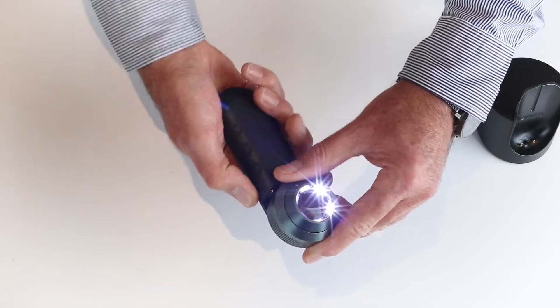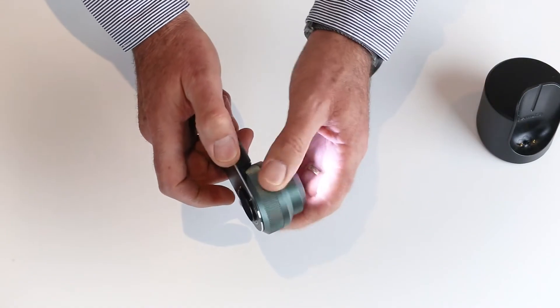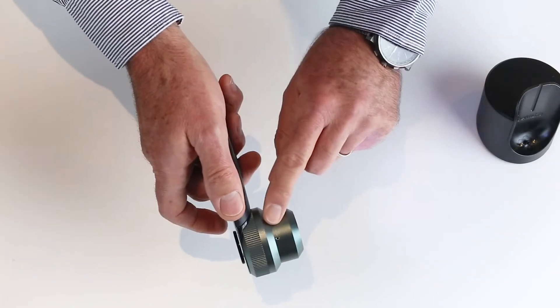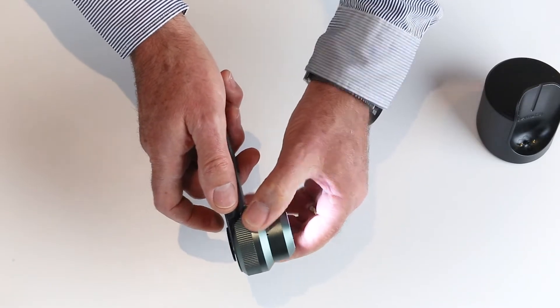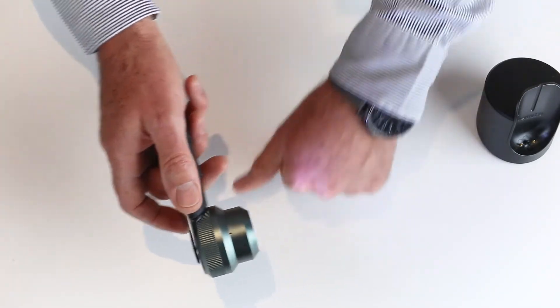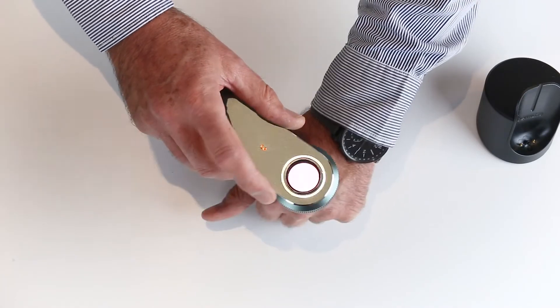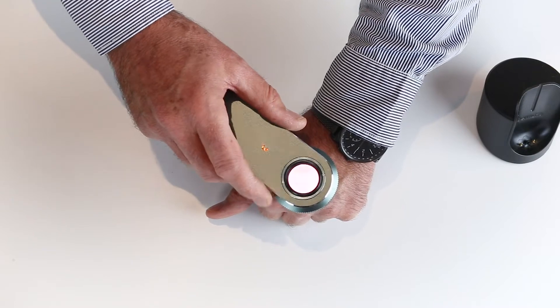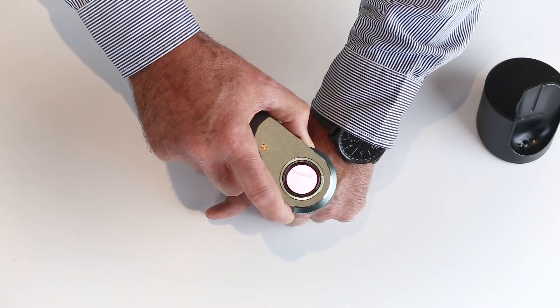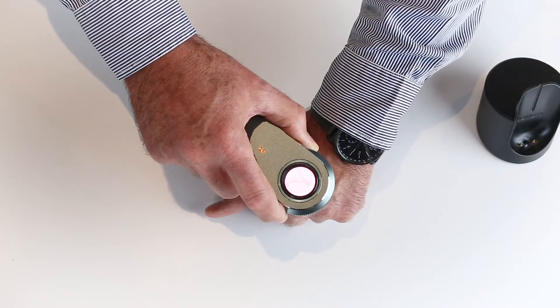When using the dermlite, wind out the spacer to the large center line. This is the perfect place to start from. Make contact with the skin and the contact plate. Take your head right down to the lens, then focus for your own vision to have a good look at the lesion.